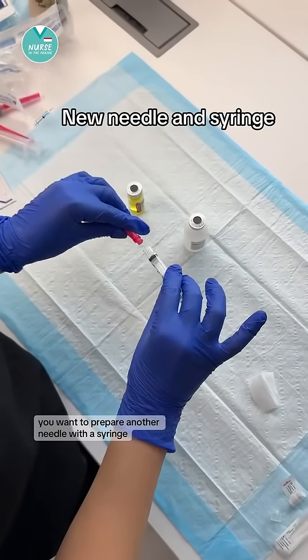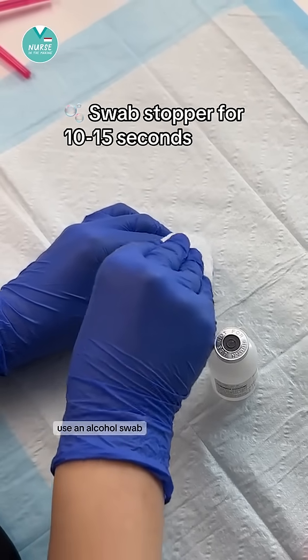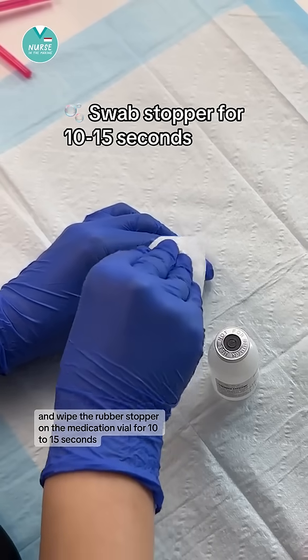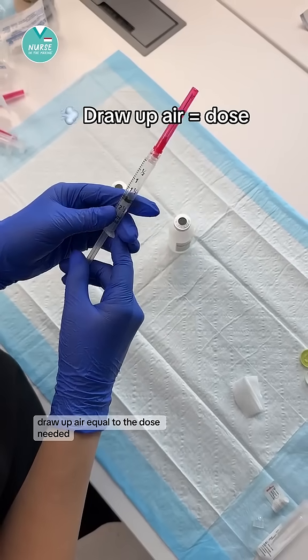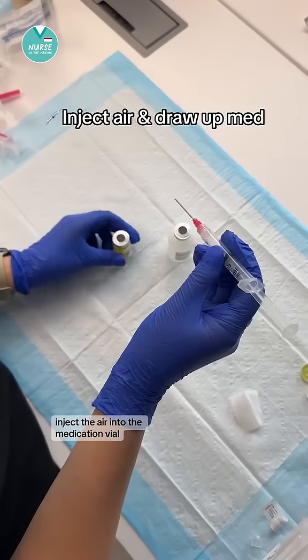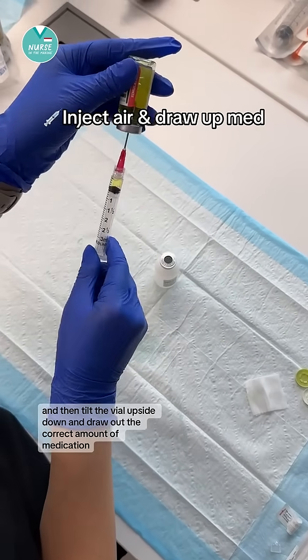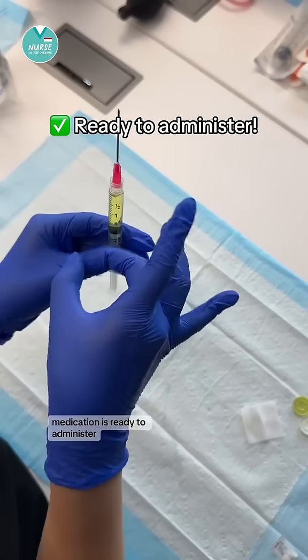You want to prepare another needle with a syringe to draw up the medication as ordered. Use an alcohol swab and wipe the rubber stopper on the medication vial for 10 to 15 seconds. Without removing the needle cap, draw up air equal to the dose needed. Inject the air into the medication vial, then tilt the vial upside down and draw out the correct amount of medication. The medication is ready to administer.